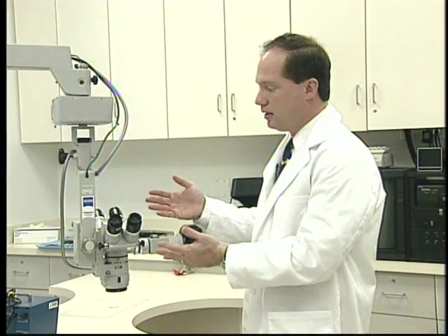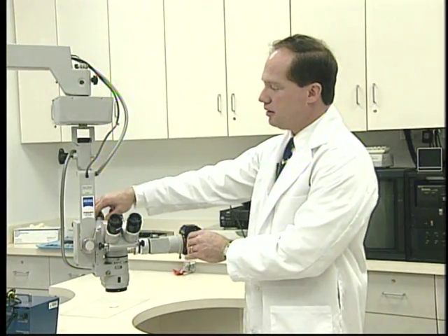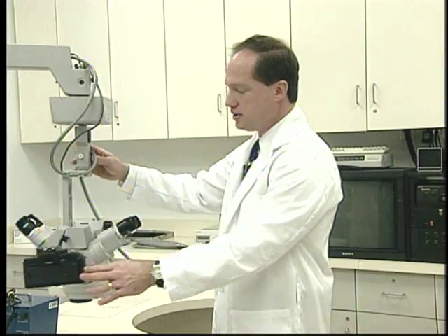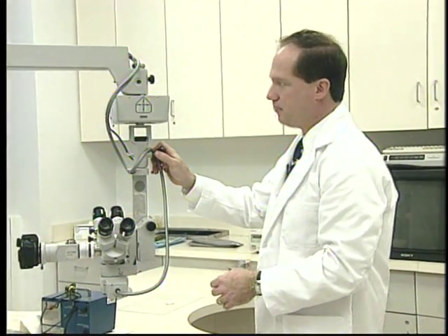Now let's go over the components of the microscope head, which is the part that you will actually be looking through during the operating technique. Usually this swings around 360 degrees, and let's take a look at the different components of it.